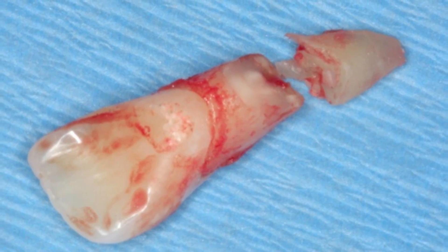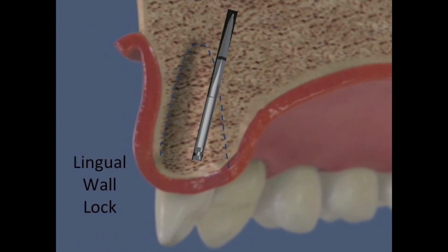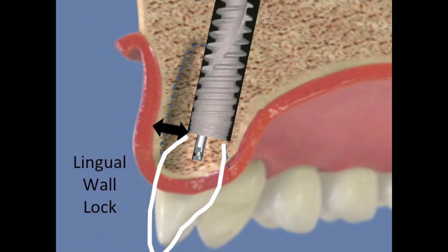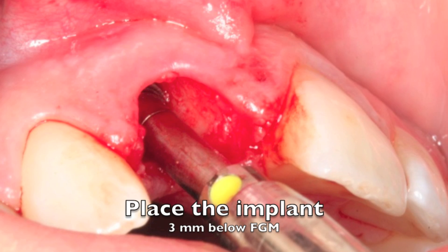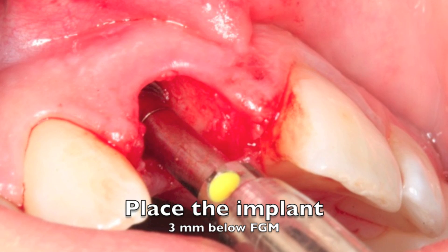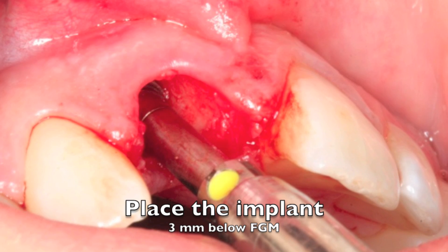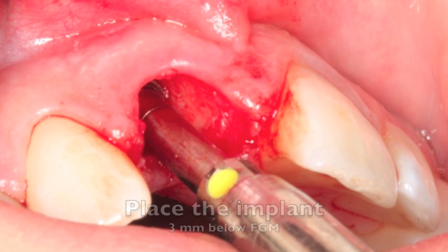Our goal when we're replacing this tooth is to make something very similar — it's going to let the area heal very quickly. We do want to go into the lingual wall and stay away from the buccal plate, and there's going to be a jump gap as shown with a black arrow. I place the implant to be 3 millimeters below the free gingival margin, as you can see on the line on the driver. This will indicate where the implant should stop to give ideal space considerations.